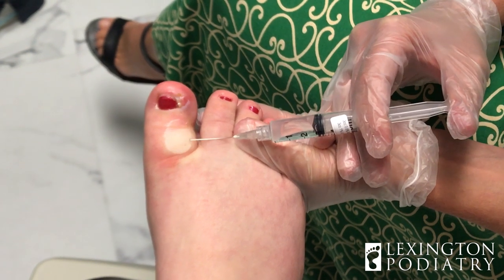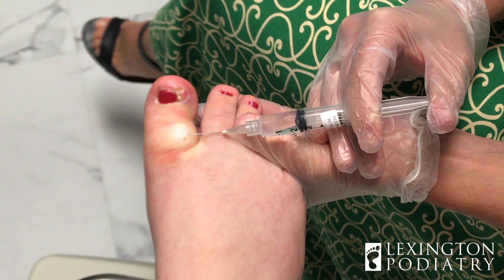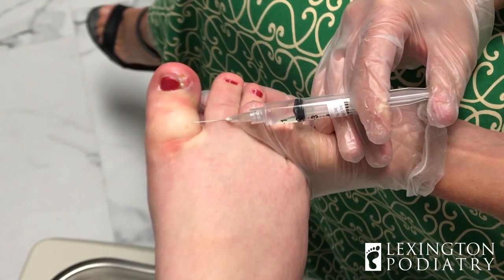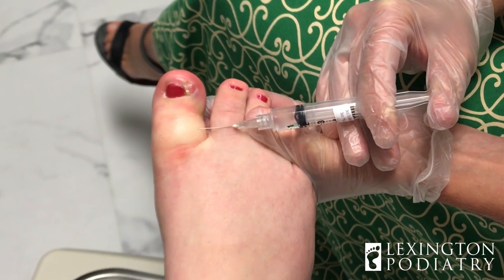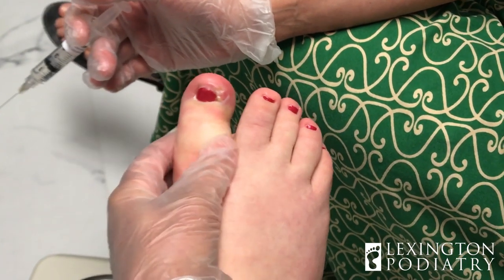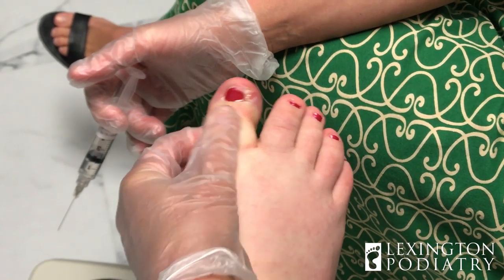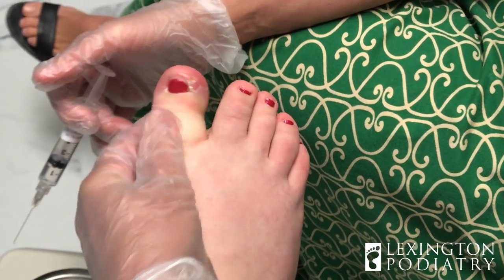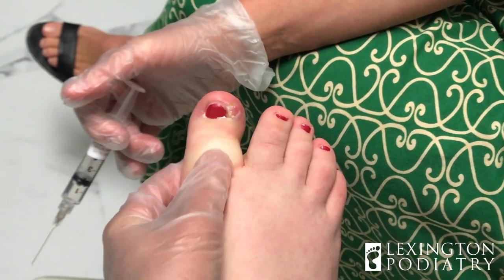Quick little stick — you're doing great. We went to Cornelius, north of Charlotte. Oh gosh, that's kind of like a bee sting? Yeah, exactly. Nice and tight — we'll massage it in a little bit. So far so good? Remember, this is the hard part. I only have one more and you're done. This is not so bad — not so bad. Good, we can handle this.